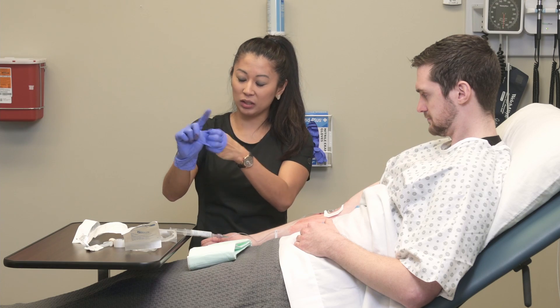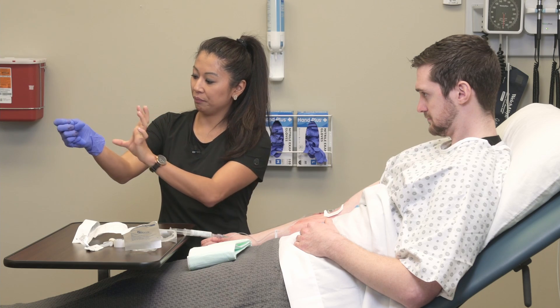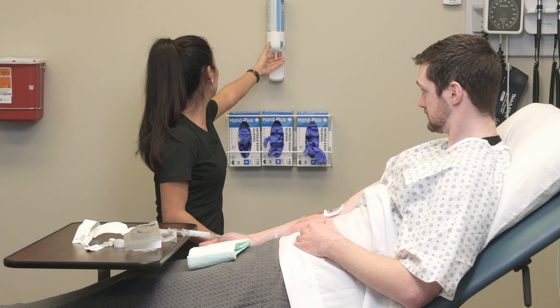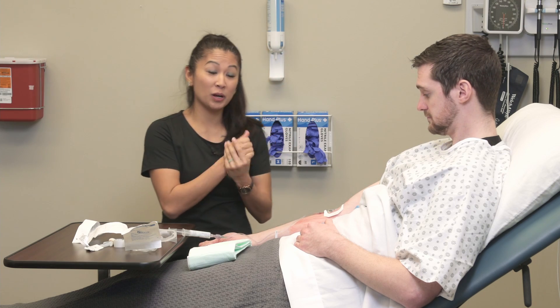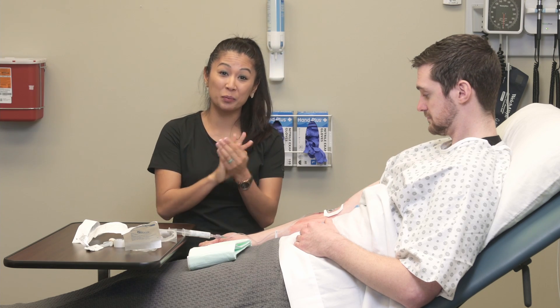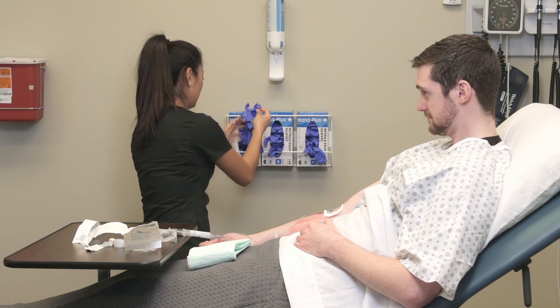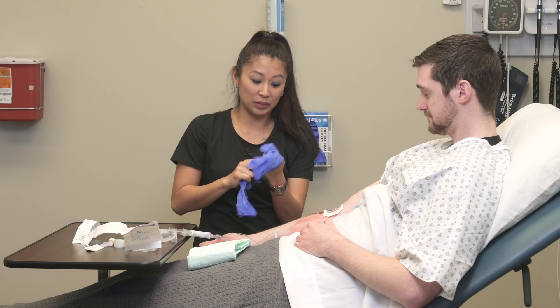Now because I've got soiled gloves, I'm going to remove these quickly and throw them in the trash. So notice this person's arm is a little bit messy — that is okay, we were clean and we can clean this up later.